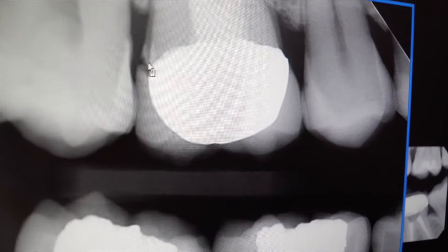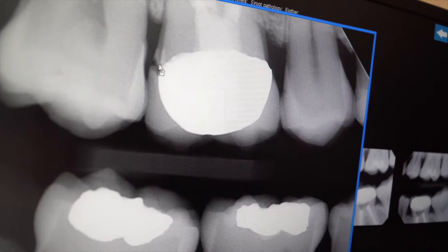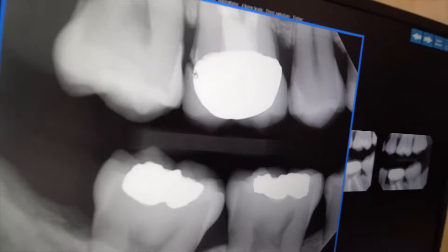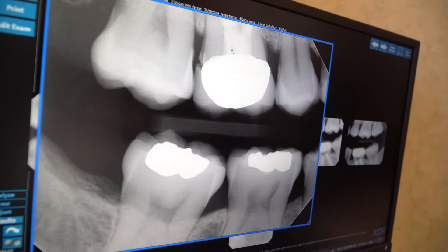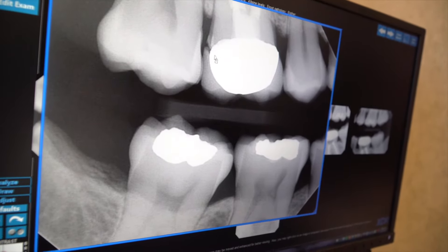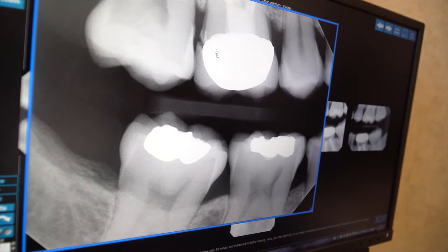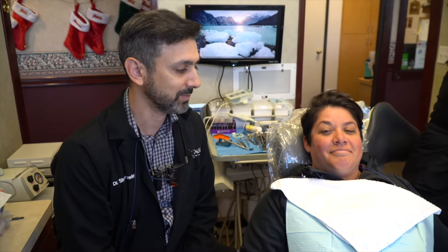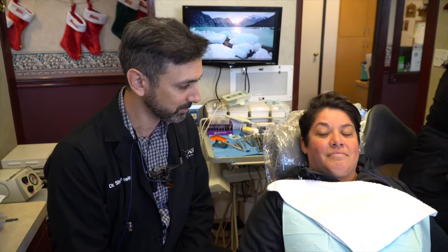Ideally you want that margin to be as seamless as possible so it's not prone to getting a cavity. At this point we're concerned that bacteria is getting underneath. She's also had a root canal before, so there's minimal tooth structure underneath this crown and we don't want to risk losing any more. So we're going to intervene today — take this crown off, clean out any decay and bacteria, and then make a new crown all in the same day. No temporary, no goopy impression material going in the mouth, and it should be a pretty comfortable process. I'm going to make sure that's the case for Jackie.